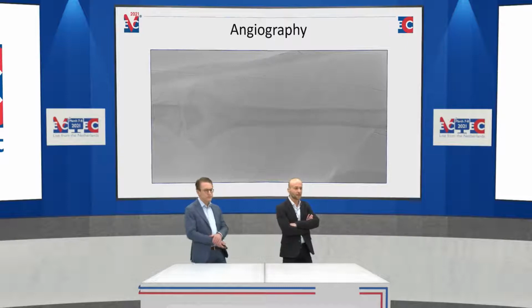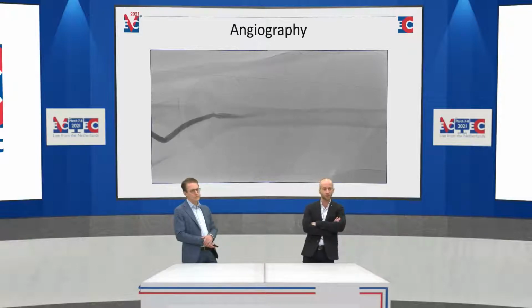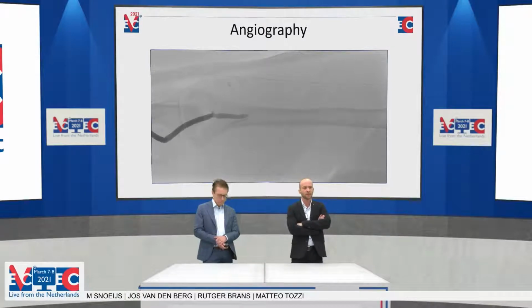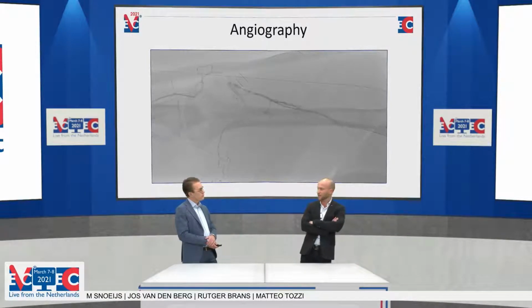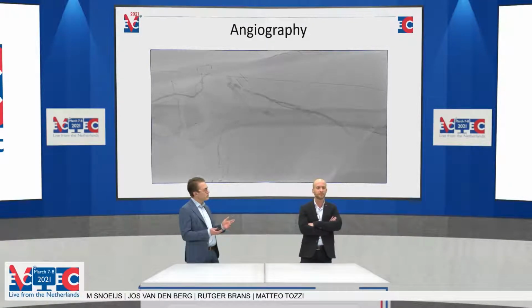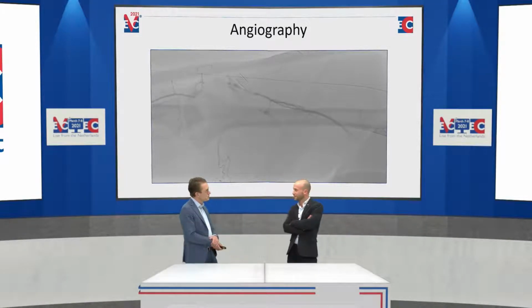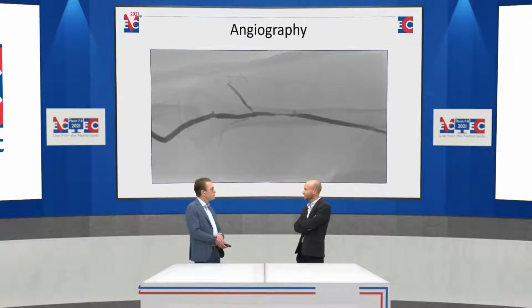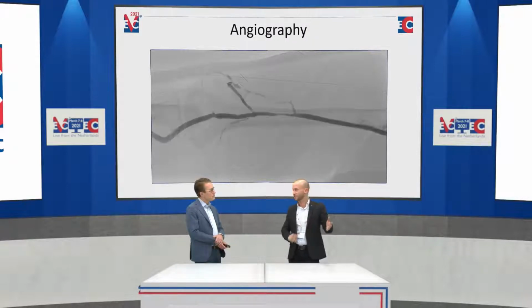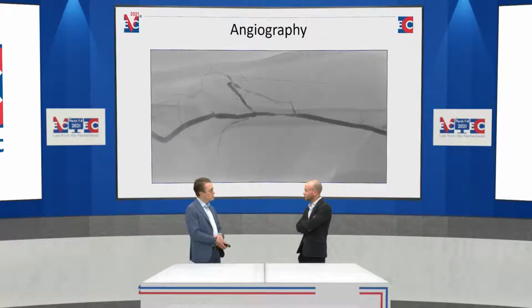Yeah, halfway up the upper arm, you see a tight stenosis, which is approximately 3 centimeters long. And you see some collateral flow as well. So that's an indication that it's a high-grade stenosis. Definitely, yeah. You already saw the prolonged bleeding time after the puncture itself. So yeah, that's definitely a venous outflow problem, and it could be the problem which should be solved.